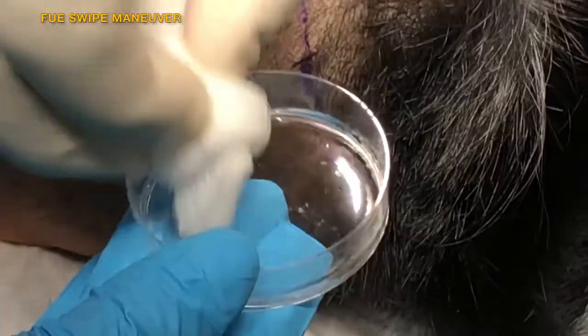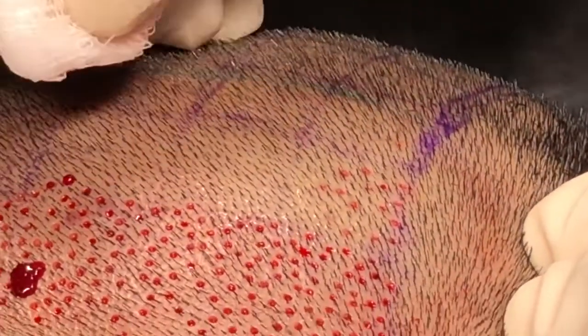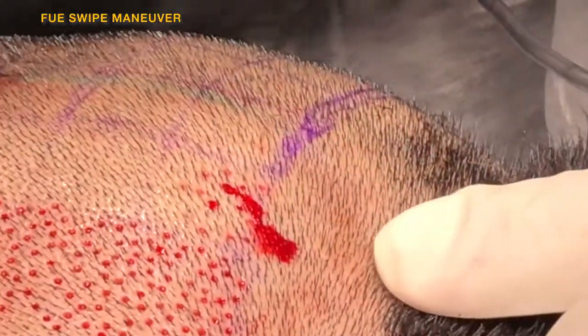To pull out the graft, the gauze is dipped into physiologic fluid and then used to swipe the area. This is the FUE swipe maneuver. In this case, all of the grafts came out with an ordinary swipe so there is no need to pick up the grafts individually.